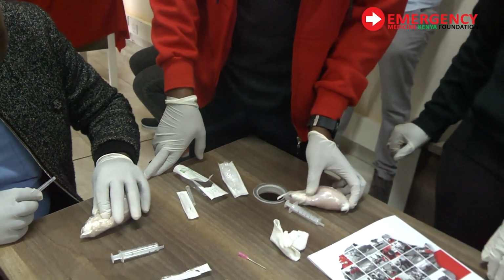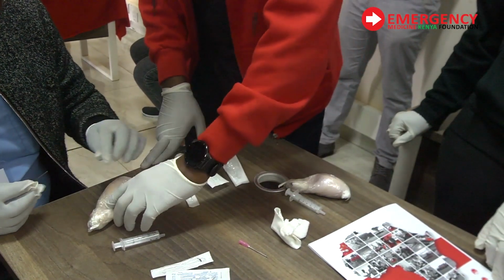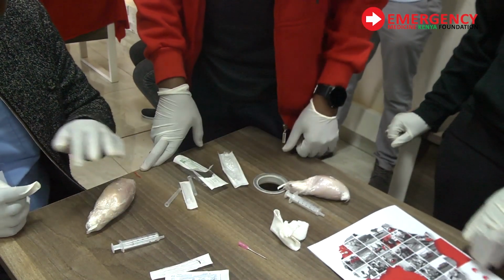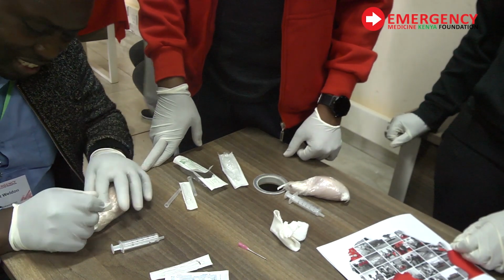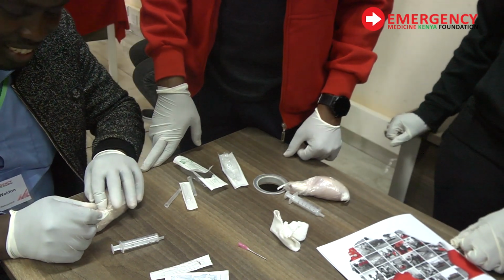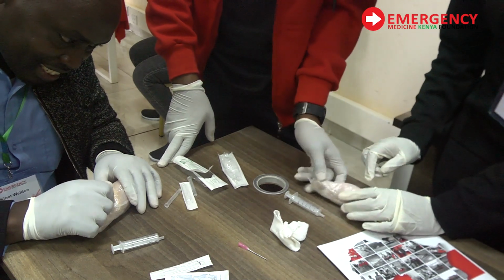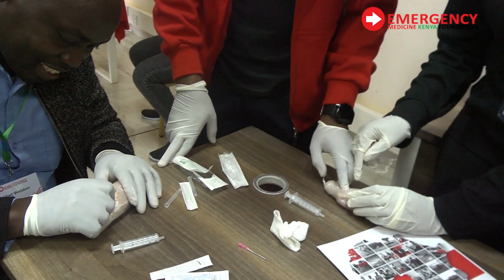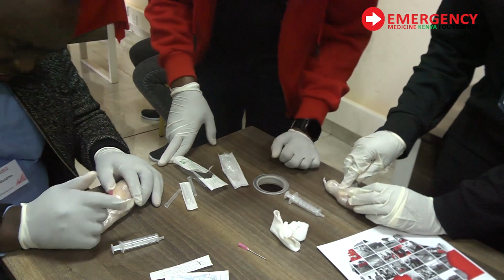For the clavicle, it's just midway in the clavicle. It's a very soft spot, flat down. Anywhere midway, not the terminal portion. As long as you're in the diaphysis, you're good. The head of humerus, any part around here, will go in very quickly. And the end of the femur. These are the same sites we use for bone marrow aspiration, the same procedure.